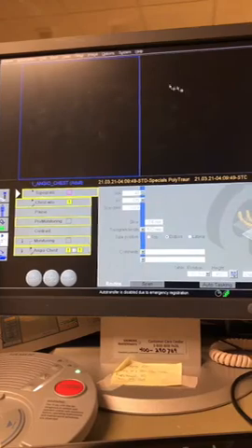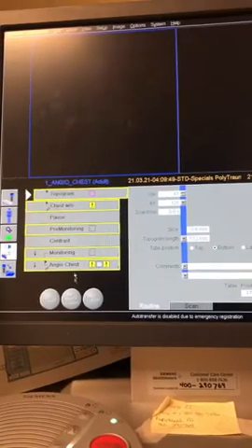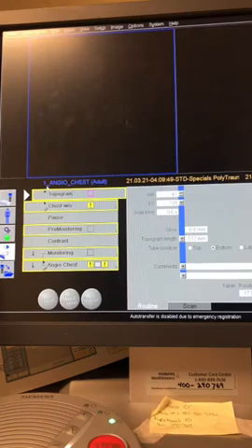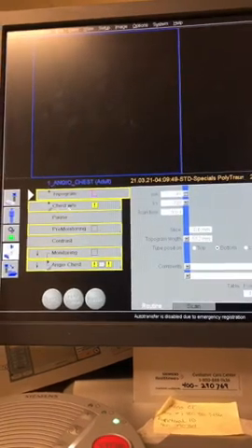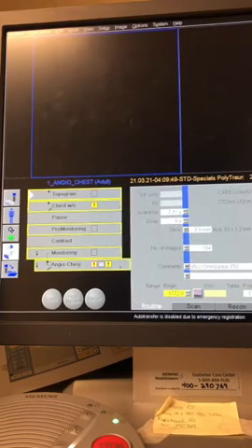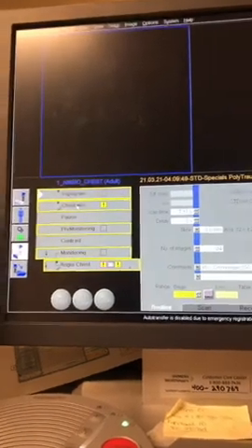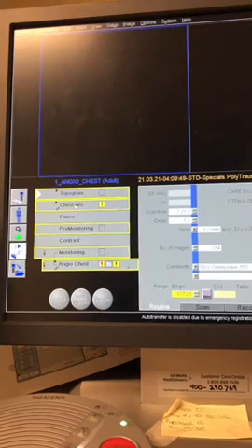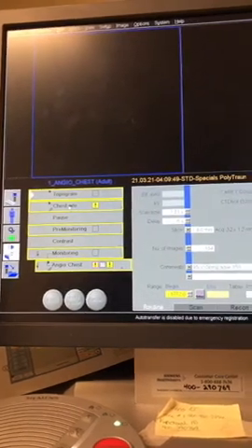All right, so we do our topogram. This is gonna look like the chest. We'll set up our scan. One thing I want you to note, different on this, as this is sequenced, on angiography, not PE angiography, but like true aortic angiographs, you have to do a without and a with. The reason is you want to see the without, because if they do have a dissection, you want to be able to tell how to compare the two, okay? Like the false lumen, the real lumen, and all that. So you have to have a without and a with.